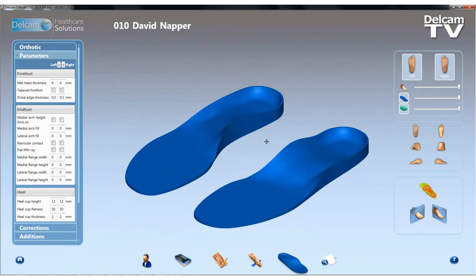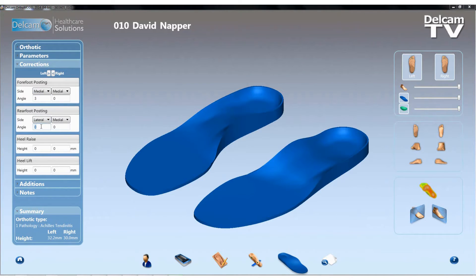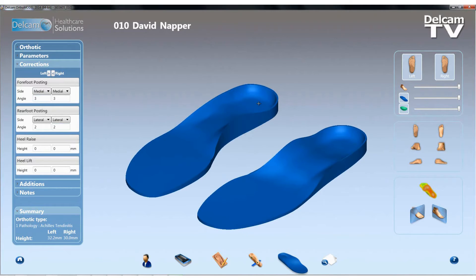So that's the new heel thickness option. Now if I move down to the corrections section of the interface, I'll set up a correction for the left foot. I want a forefoot post angle of 3 degrees to the medial side and a rear foot post to the lateral side of 2 degrees. So my left orthotic is now set correctly. Now if I want exactly the same parameters on the right hand side, we can use these mirroring options. If I click the button which will send the values across to the right hand side, all those values are sent across and we effectively mirror the corrections from one side to the other.